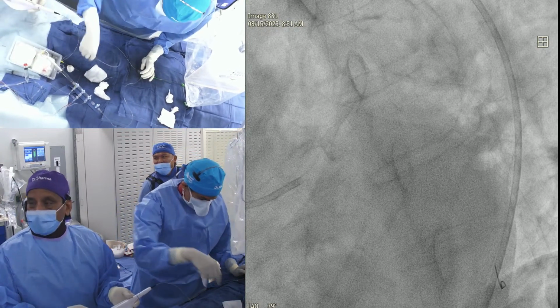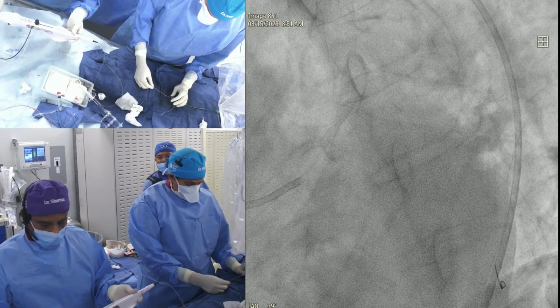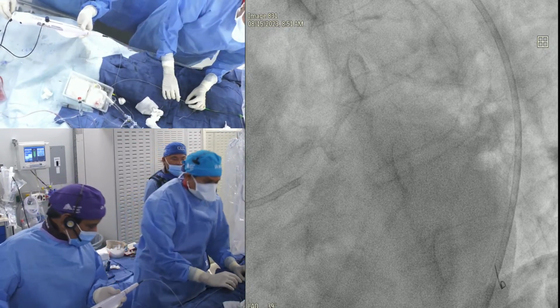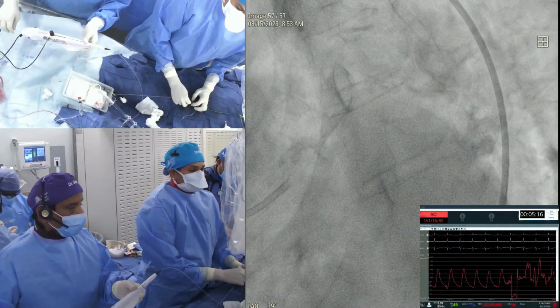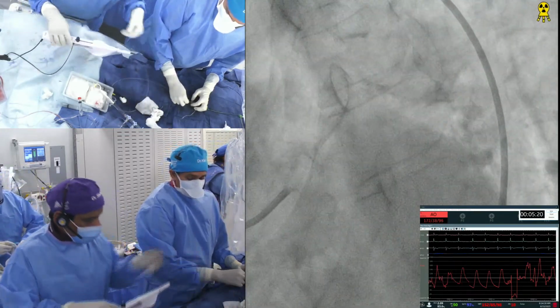We are ready to check the speed. Usual. 0.9. Good. Fine. Which one? 0.9. Yeah, go. Oh, you mean the laser? Yep. Okay. Now, right now we are going with rota. So don't stop it yet. In case rota has trouble, we will go to the laser. 1 second. This is a 1.5 burr now.